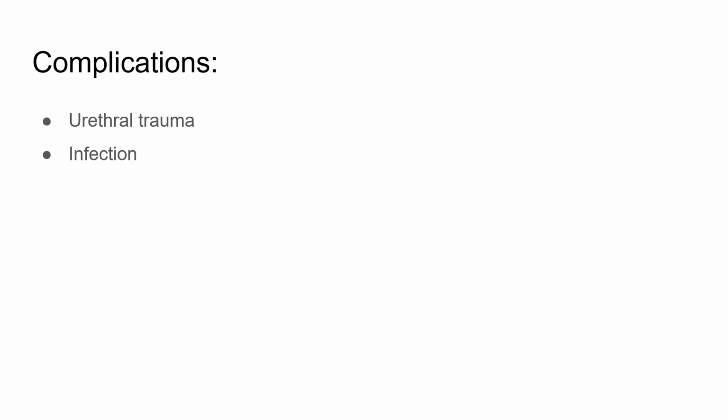So moving on with the complications. Urethral trauma is one complication, wherein if the catheter is not fully inserted into its position and in between it is inflated, in such a condition urethral rupture or urethral trauma occurs, which may end up as a urethral stricture. So stricture urethrae should not occur. That's why care has to be taken. At the same time, infection. As I said earlier, long-term catheterization is associated with an increased risk of urinary tract infection. So as far as possible, urethral catheterization should not be encouraged.